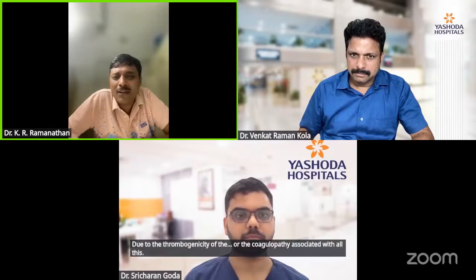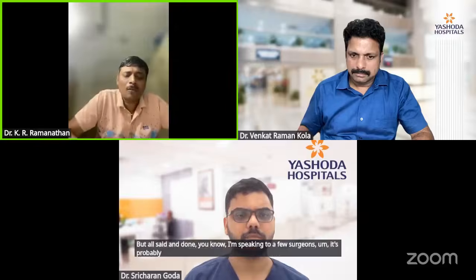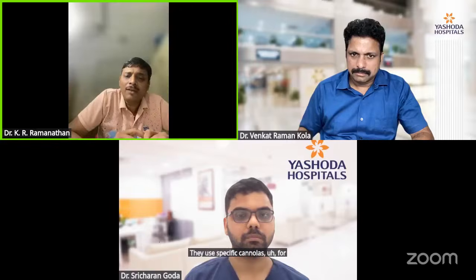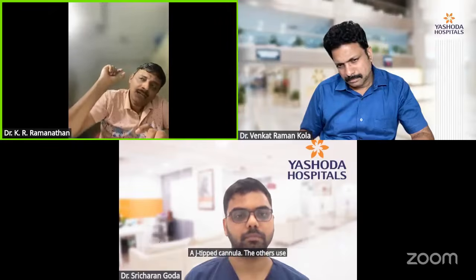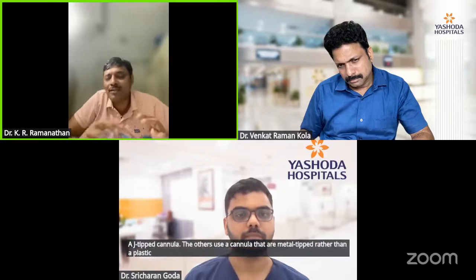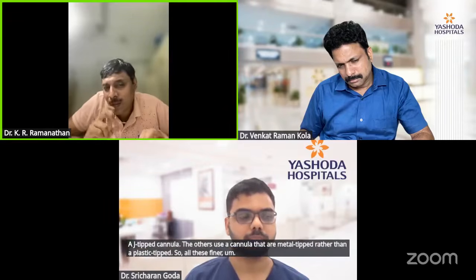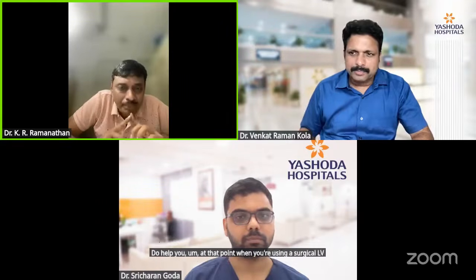But all said and done, I'm speaking to a few surgeons. It's probably one of the problems which we faced. A lot of others don't face it. They use specific cannulas for venting LV. Some of them use a J-tipped cannula. The others use cannulas that are metal tipped rather than plastic tipped. So all these finer technical aspects do help you at that point when you're using a surgical LV vent.